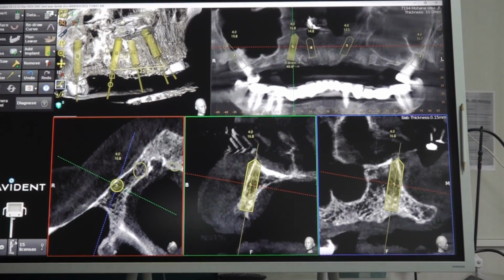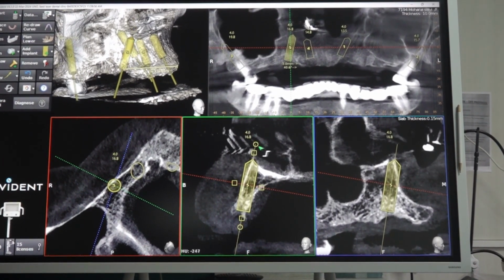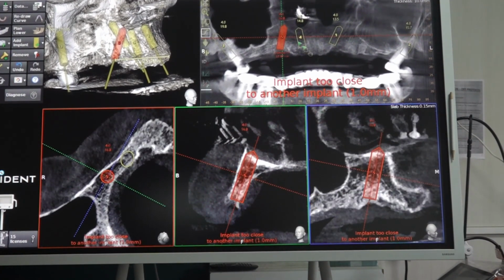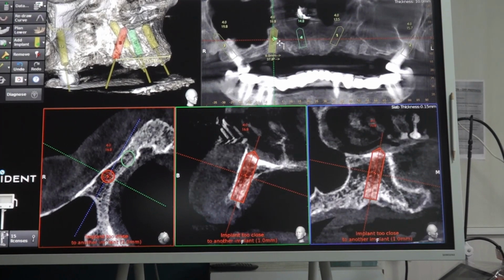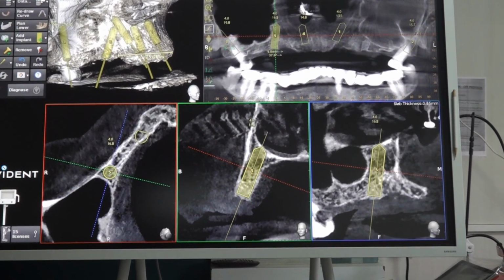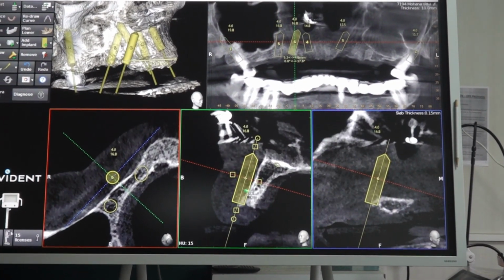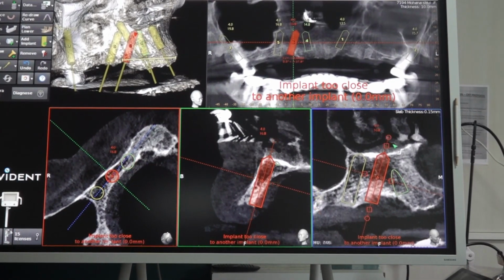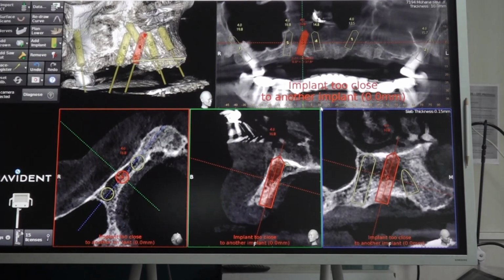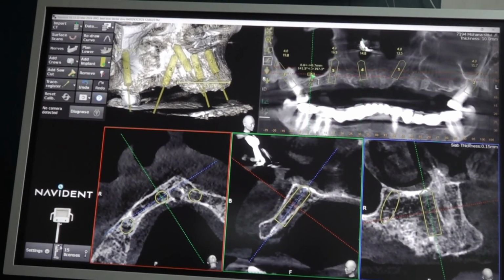This is the buttress area. Okay. But there is no advantage. We'll stick to this premolar plan. Again, the bone quality is good. One implant. We can even place an additional implant in between here. You will see. No. This is enough. We'll try the molar areas.